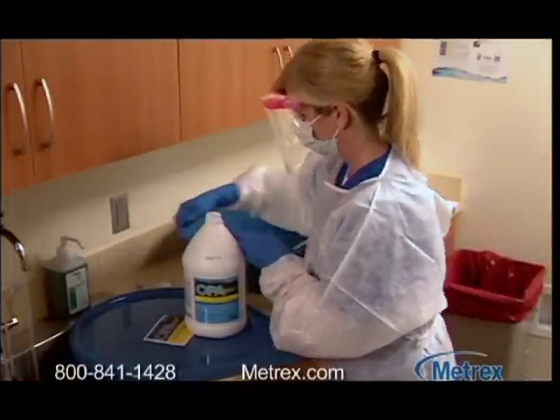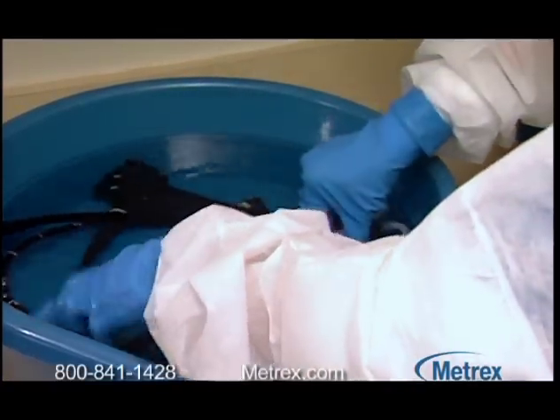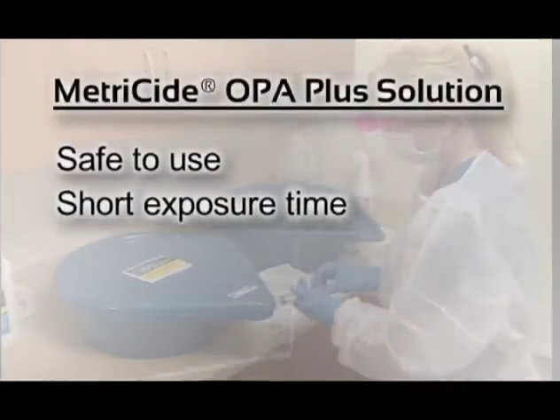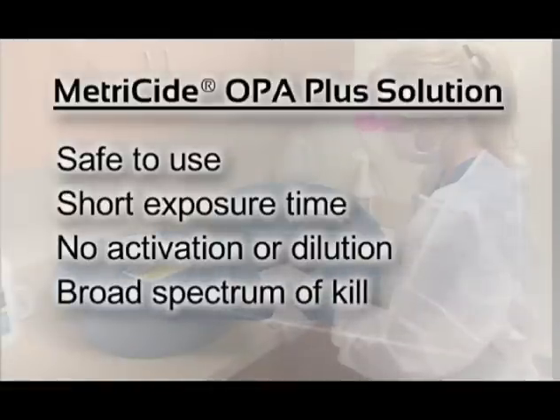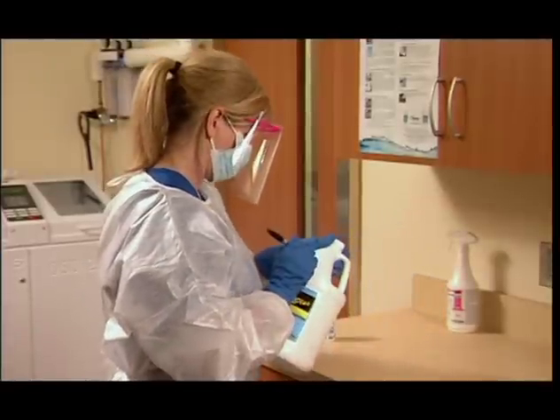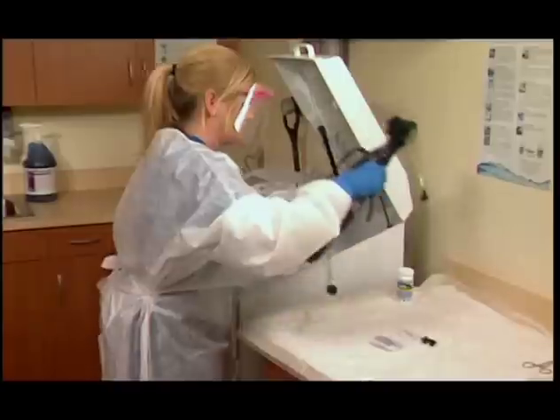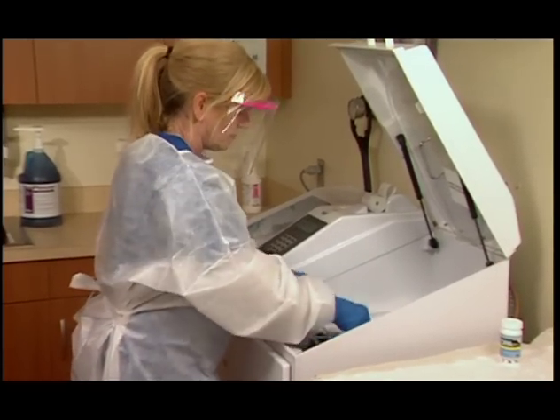The key to successful high-level disinfection is selecting and properly using the correct solution. When compared to other chemicals for high-level disinfection, such as glutaraldehyde, Metricide OPA Plus Solution with 0.6% orthophthalaldehyde has many benefits. It is considered safer to use, offers a shorter exposure time, is ready to use and does not require activation or dilution, and provides a broad spectrum of kill against viruses, microorganisms, and fungi, while being gentle on instruments. In addition, it may be reused for up to 14 days when monitored according to label instructions, contains 0.05% more OPA than the competition, and when using an automatic endoscope reprocessor, provides up to 40% more reprocessing cycles — meaning greater effectiveness and cost savings.